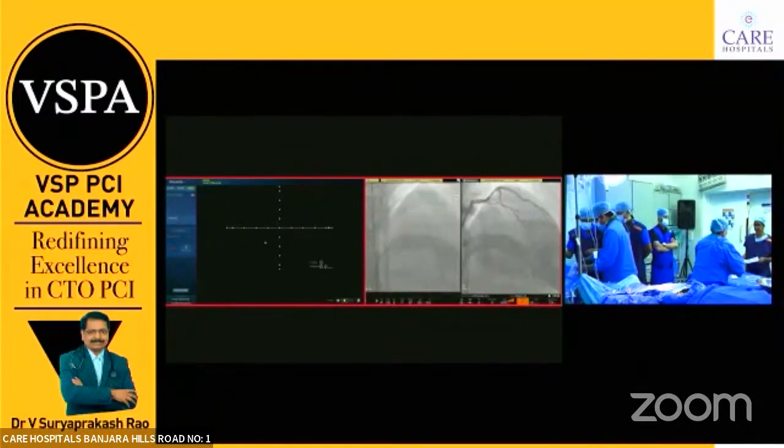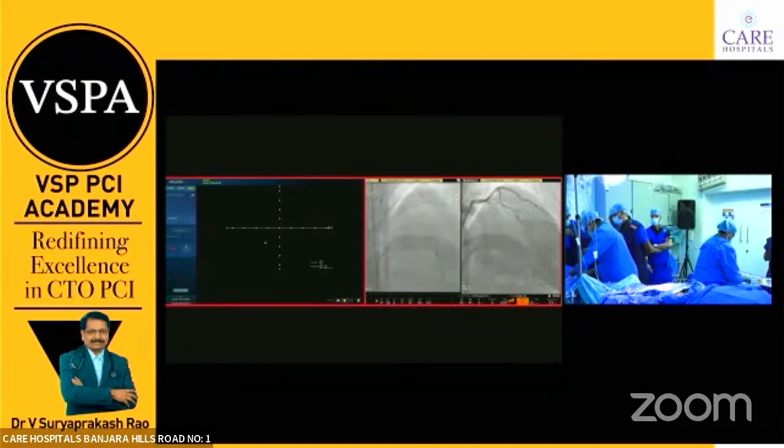Need some water. They will get it. Shaji, this will be over in another 1 hour meantime. Maybe we'll do some Wolverine balloon for the proximal, then see how much stenting, how much drug-eluting balloon.